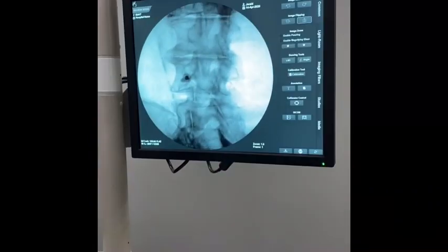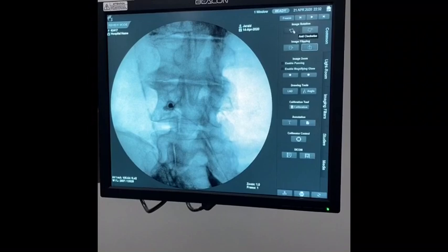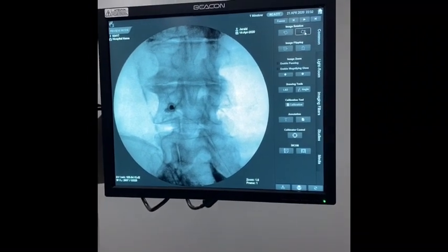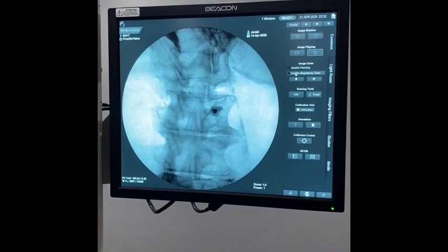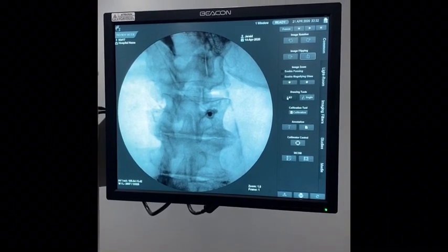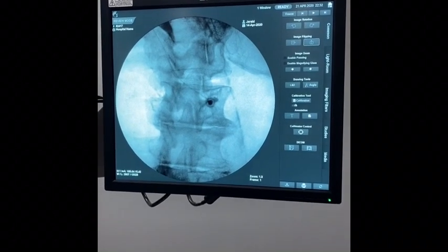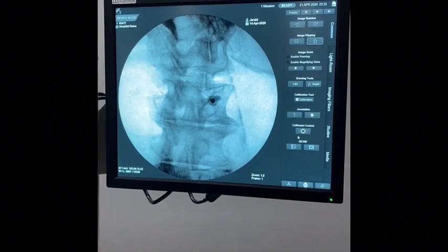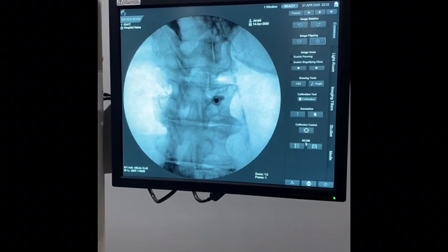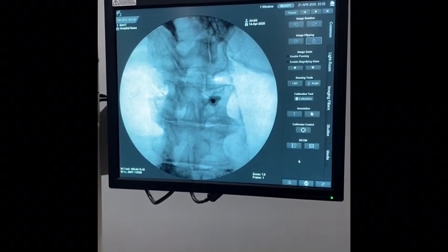Getting into the software functions, you have image rotation, image flip, panning, magnify glass, drawing tools, measurement tools, calibration tools, and annotation. You have your collimator, and DICOM if you want to send images to your PACS system or your EMR — you can do all that within here. You can also print.